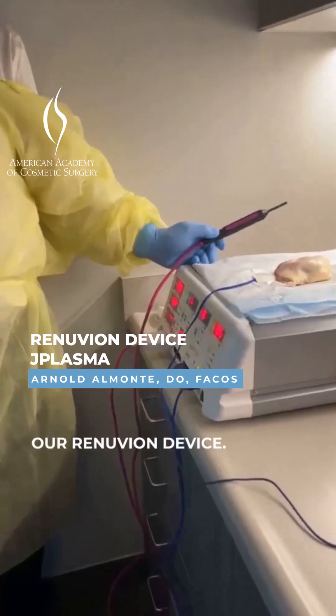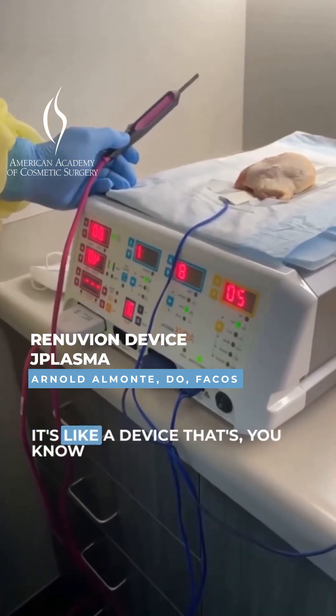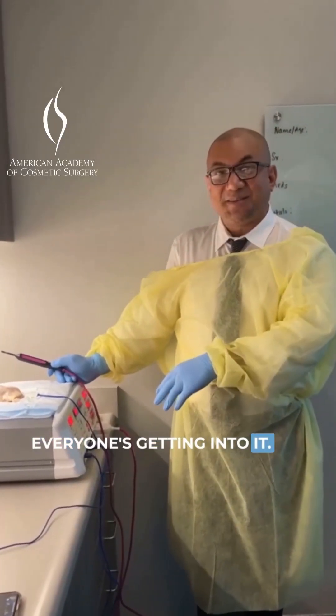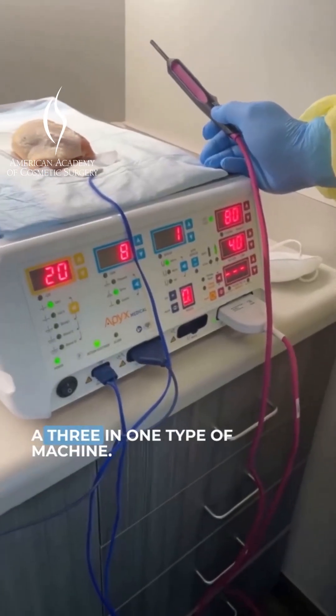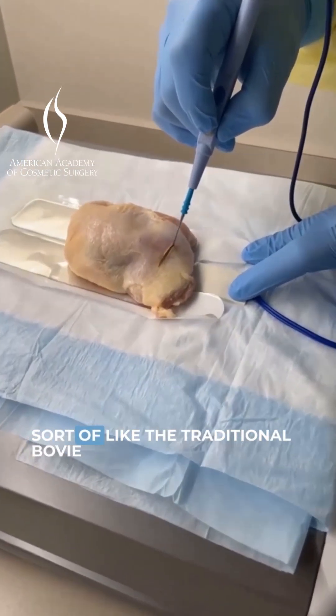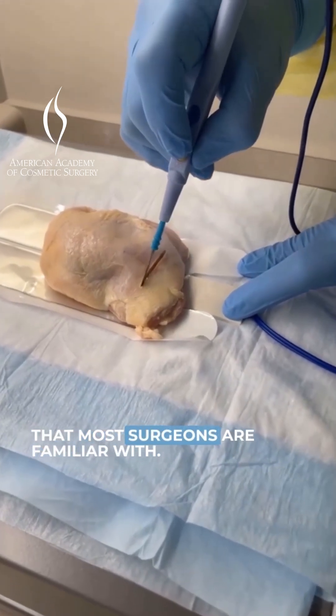I want to show you guys a little bit about our Renuvion device. It's a device that's breaking records worldwide. Everyone's getting into it. It's really like a three-in-one type of machine. It can be used for cutting, coag, sort of like the traditional bovie that most surgeons are familiar with.